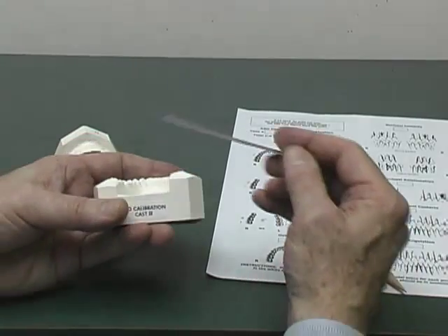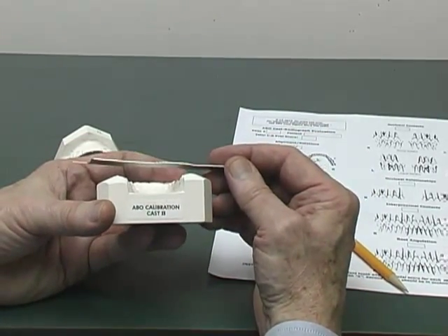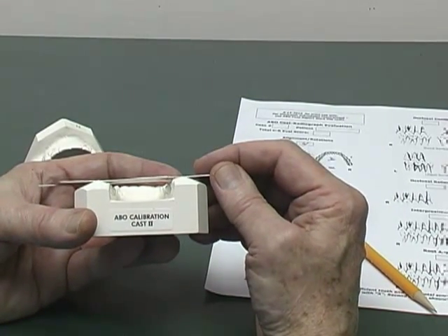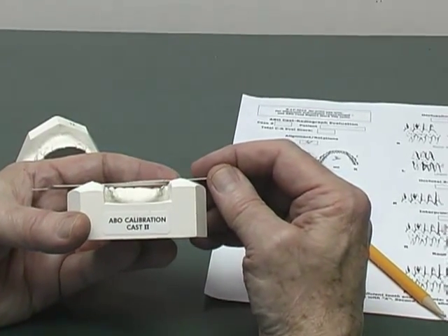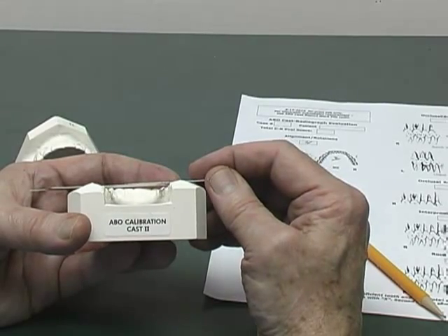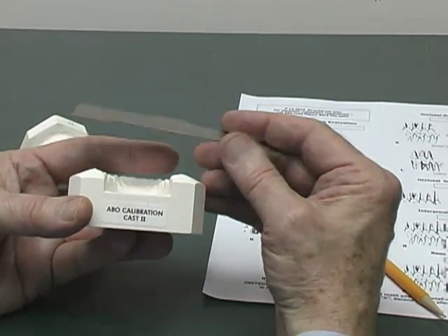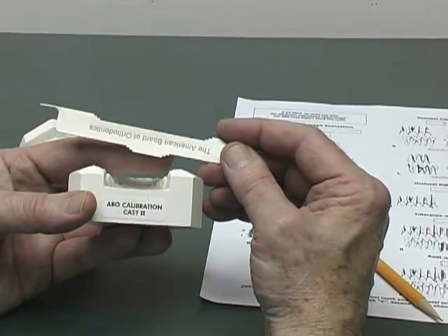Again, we can look from the posterior using the flat side of the gauge back and forth. Again, we can see there are some difficulties there. Looks like problems also. We flip the gauge over to the top of the gauge.